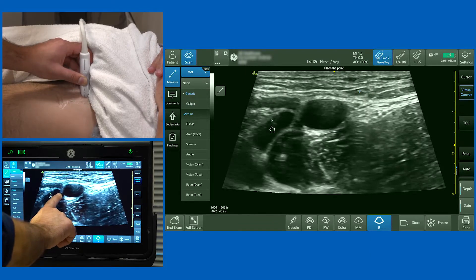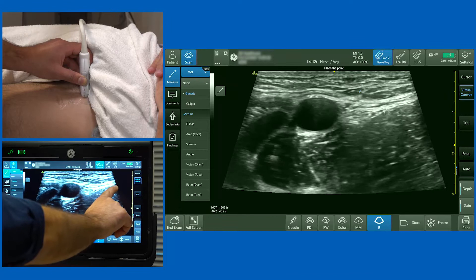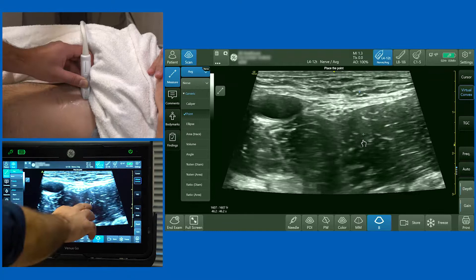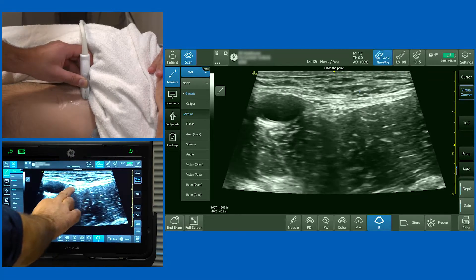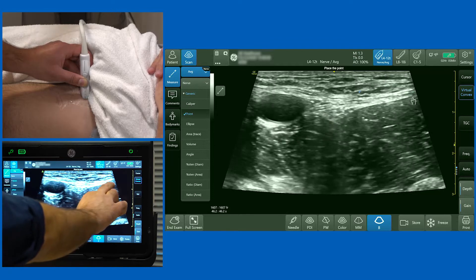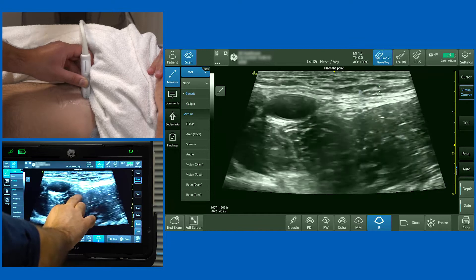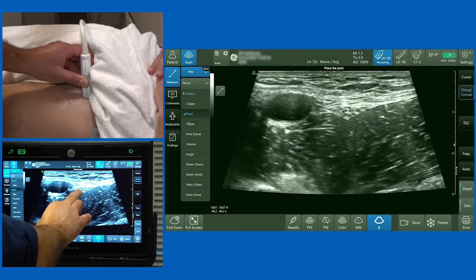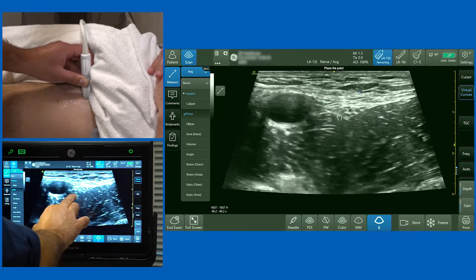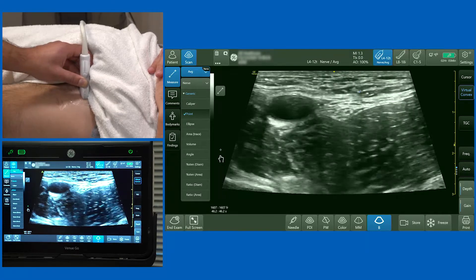So the femoral vein is most medial, then the femoral artery, and then we've got the iliopsoas muscle. As I bring my focus of attention to the center of the screen, you can see a structure lying right on the surface of the iliopsoas muscle, underneath the fascia iliaca — this structure is the femoral nerve.